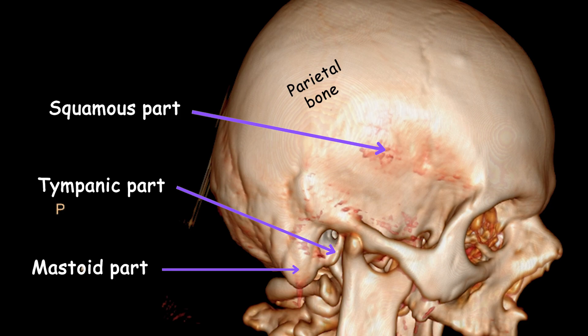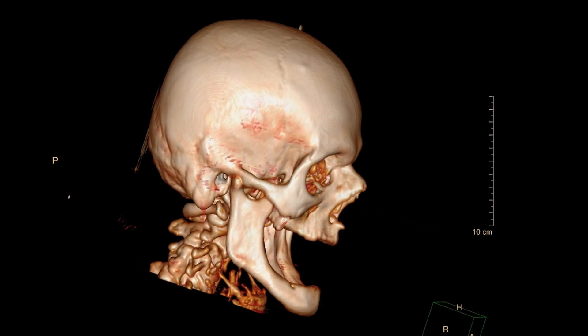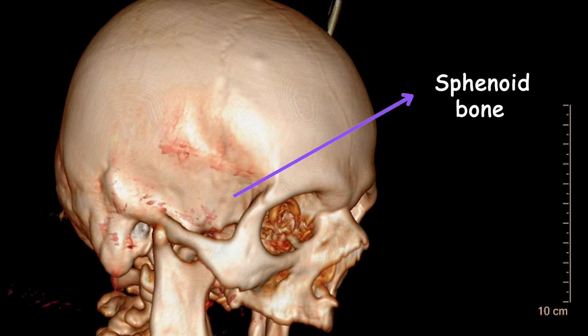The squamous part is a flat, thin section that forms the lateral surface of the skull. The mastoid part is located posterior to the petrous part and contains air-filled spaces called mastoid cells; it has a bumpy texture due to its mastoid process, which serves as an attachment site for muscles. The tympanic part is a small section that contributes to the formation of the external acoustic meatus, or ear canal. Anterior to the temporal bone is the sphenoid bone, a complex cranial bone situated at the base of the skull in the central region, known as the middle cranial fossa.